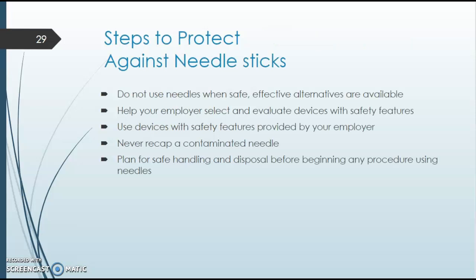Steps to protect against needle sticks. Do not use needles when safe, effective alternatives are available. Obviously, we want to stay away from using needles, but we have to in phlebotomy, and so the needles with the safety device is always preferred to protect ourselves as well as our patient.